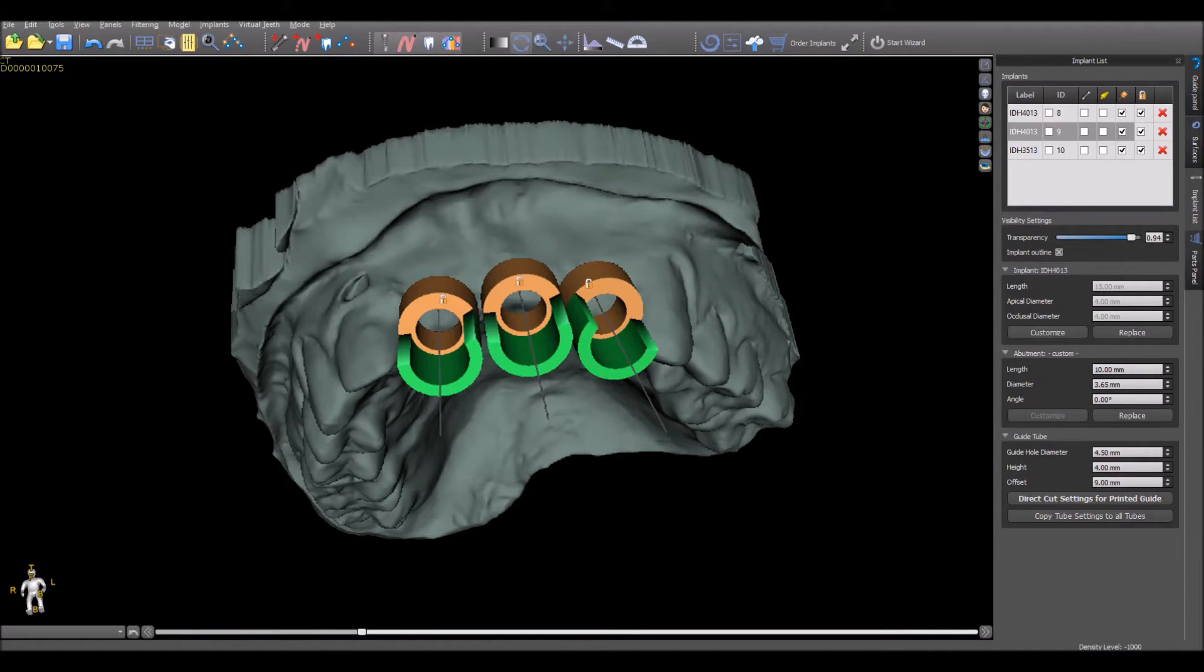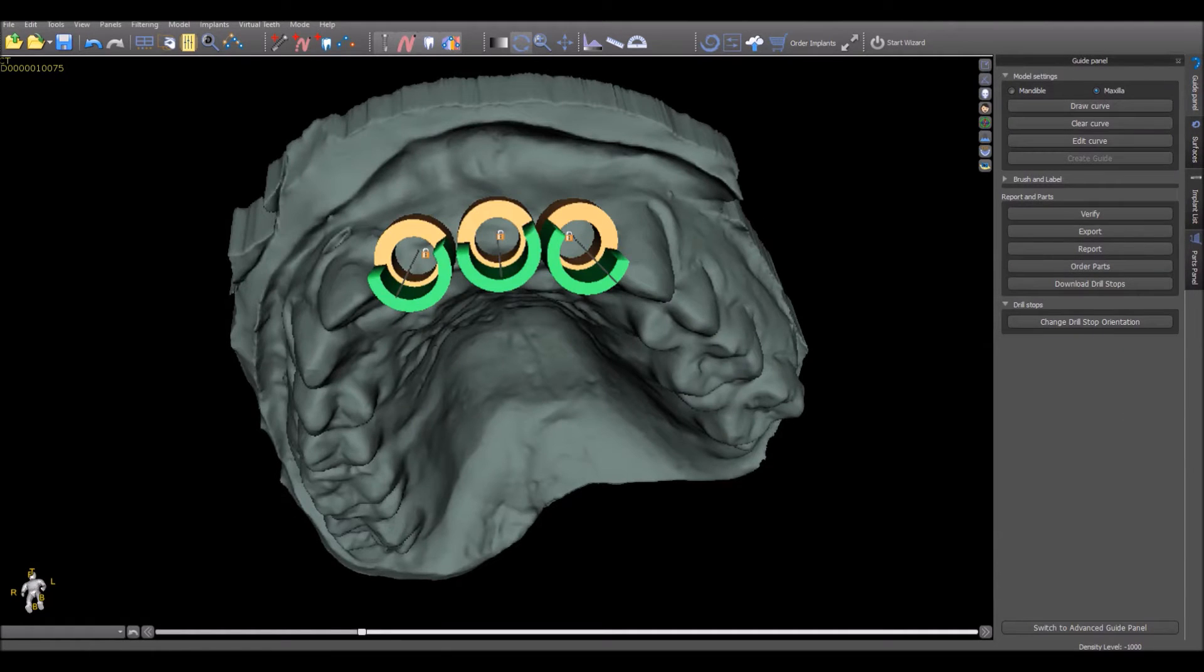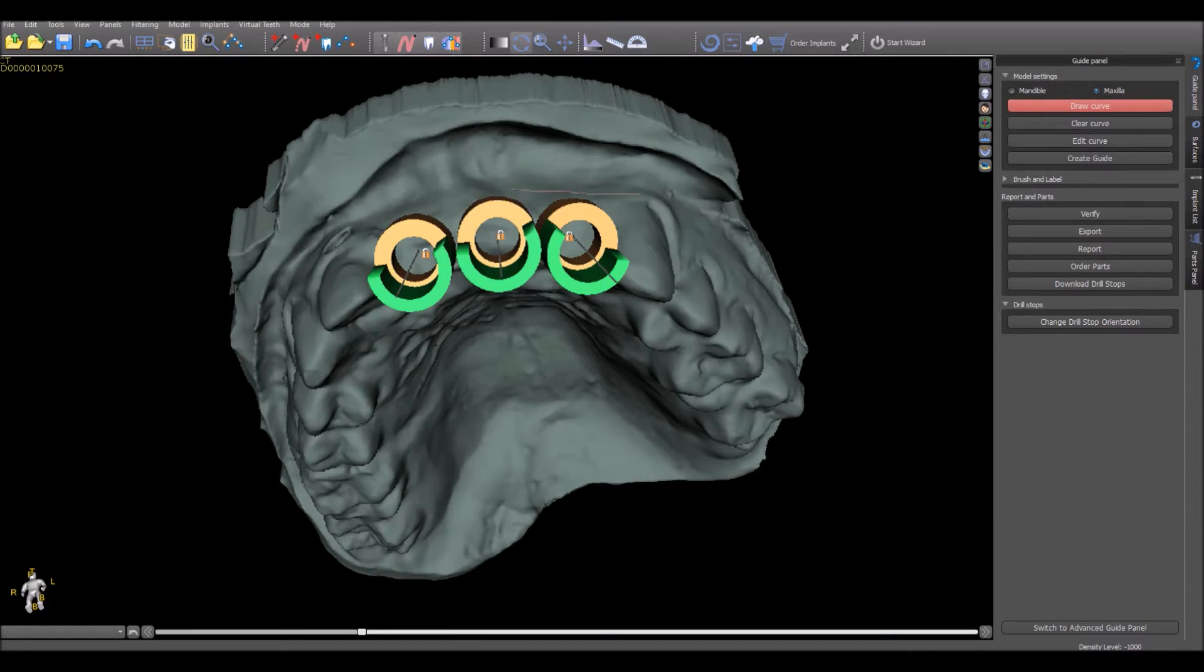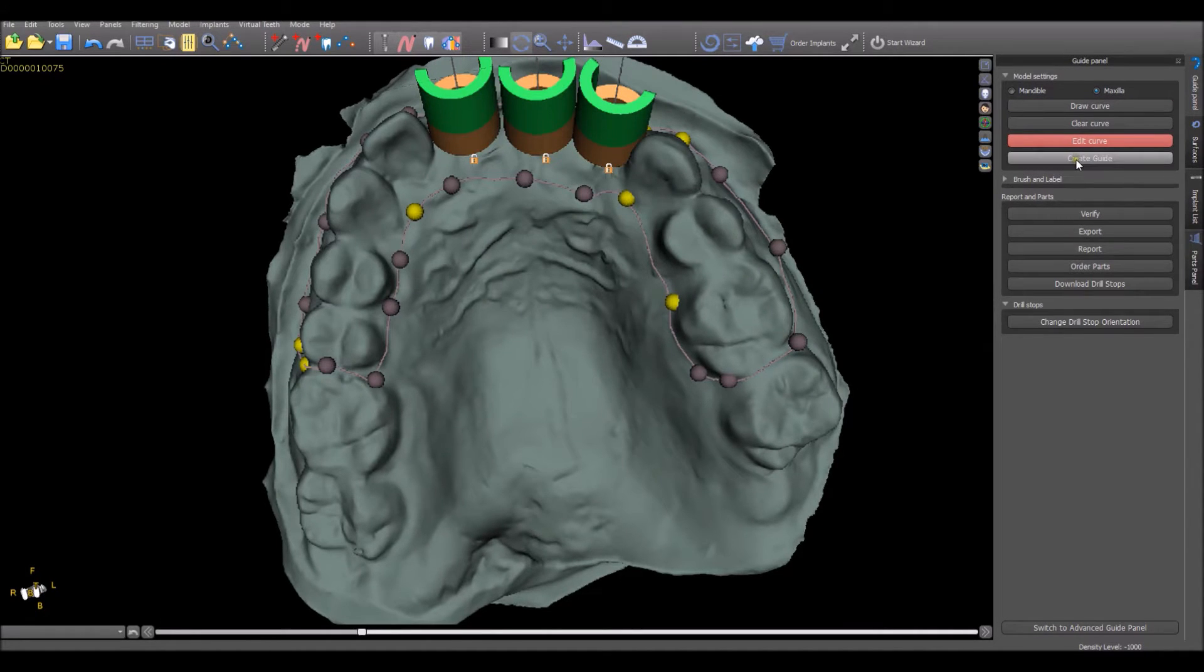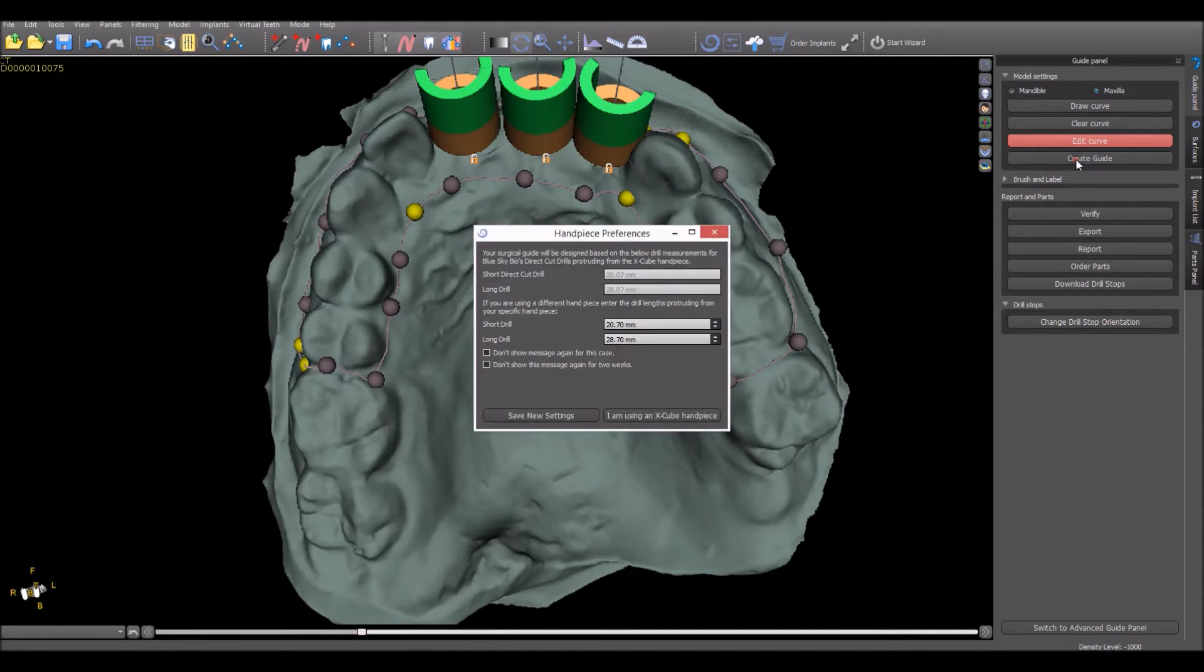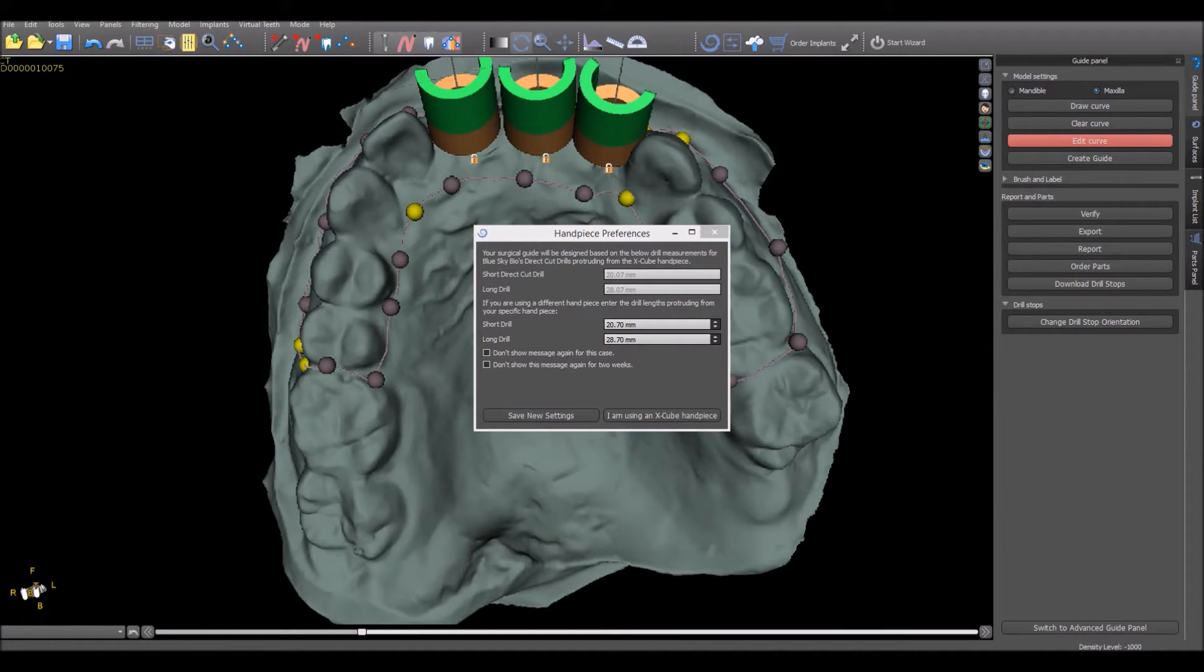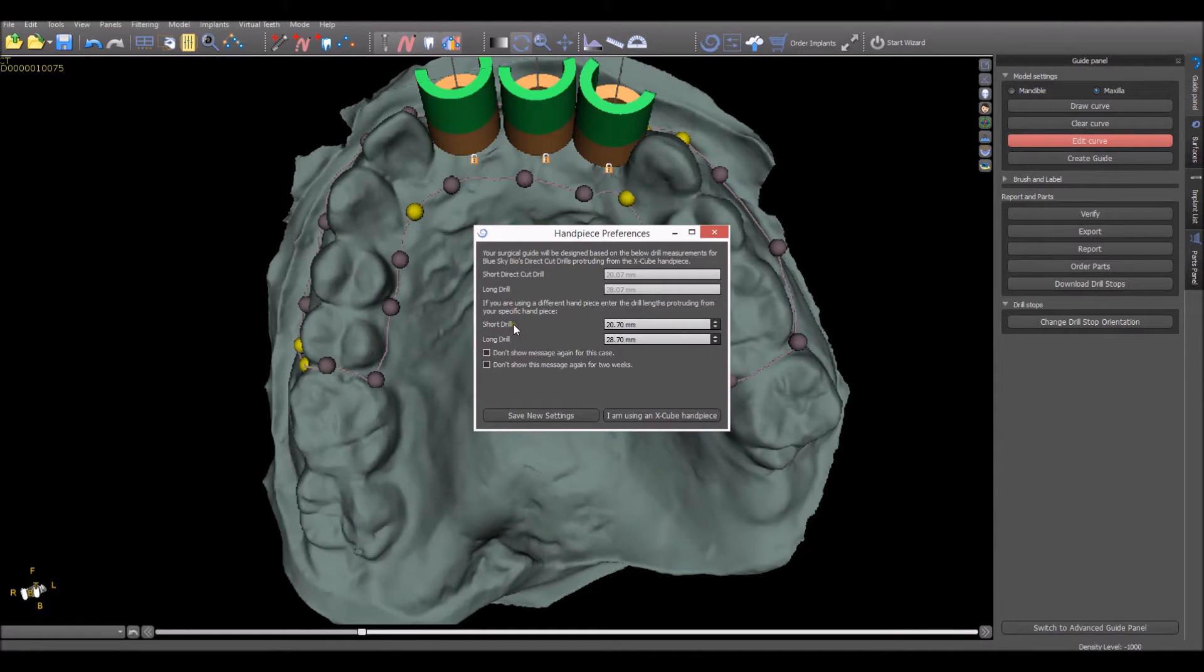The process of creating the surgical guide has not changed. Once the curve is drawn and the user clicks on the Create Guide button, a dialog box appears on the screen. The drill lengths of the drill extending from the X-Cube handpiece appear up here on the screen.